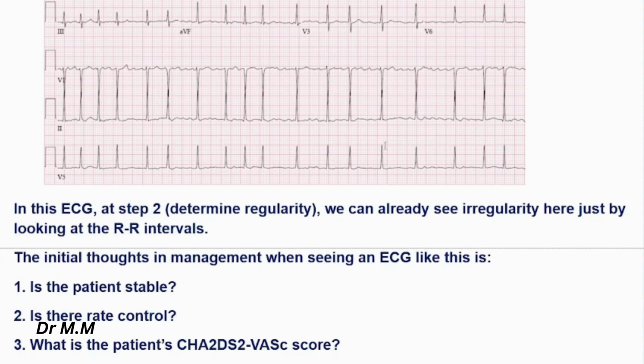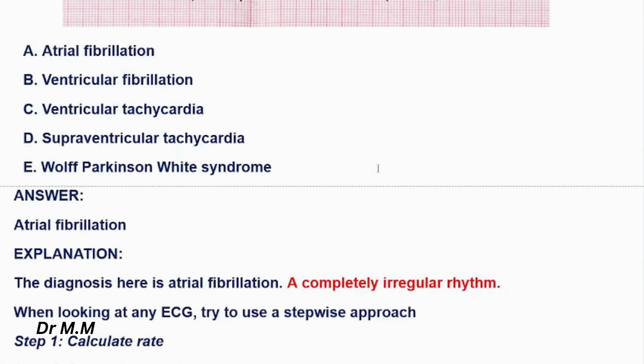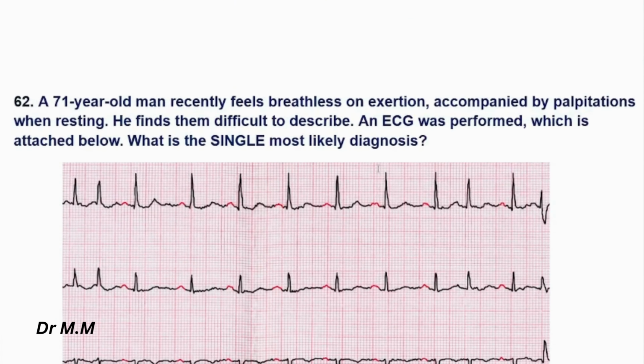In other YouTube videos, we explain about the patient's score and whether they can receive treatment. We talked about it in our YouTube videos. For more information, you can watch them. Here was a short explanation about the patient coming with atrial fibrillation.